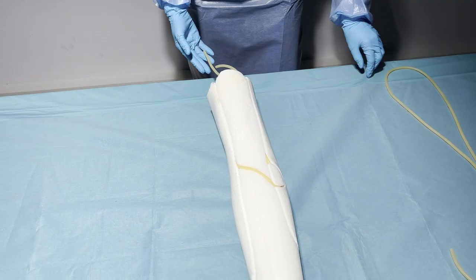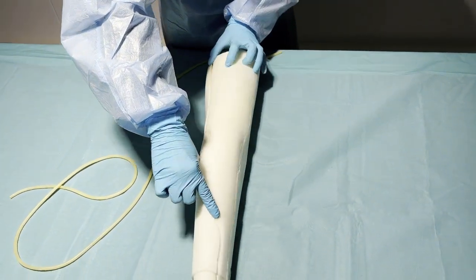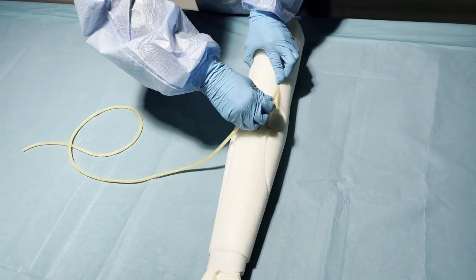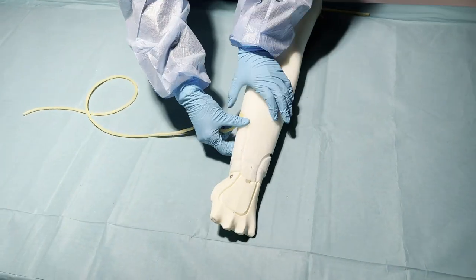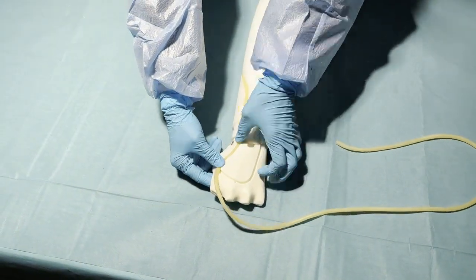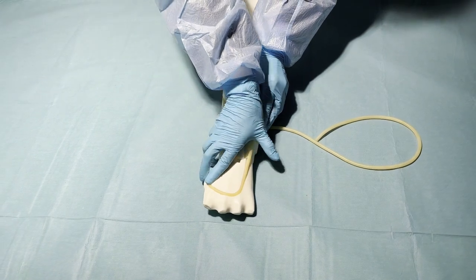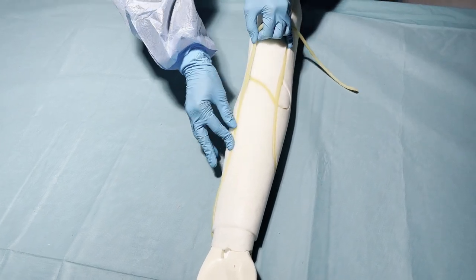After you have placed the first vein in, you can now take the longer one and put it in around the loop at the dorsal of the hand. Make sure that the vein is not covered yet, because afterwards when you roll back the skin, it will put the vein securely in its place.